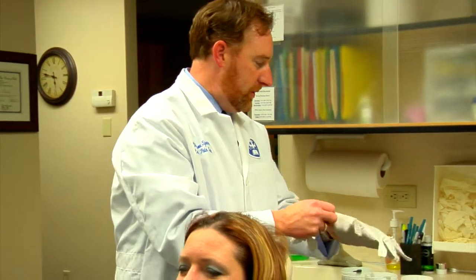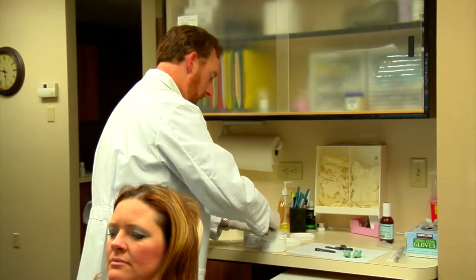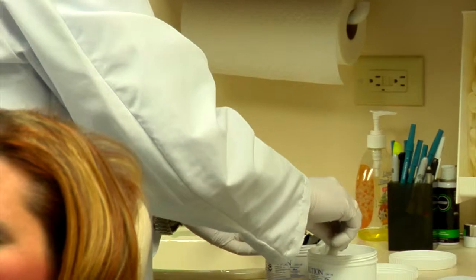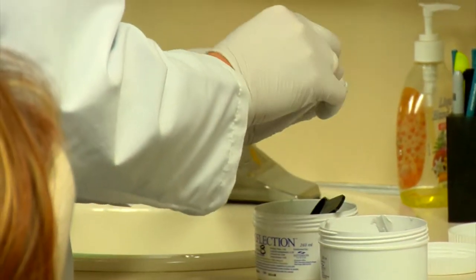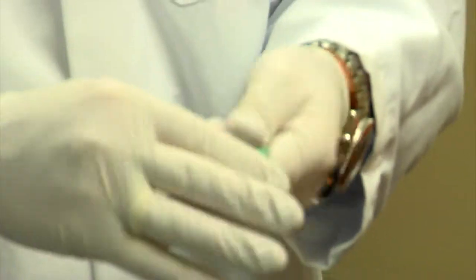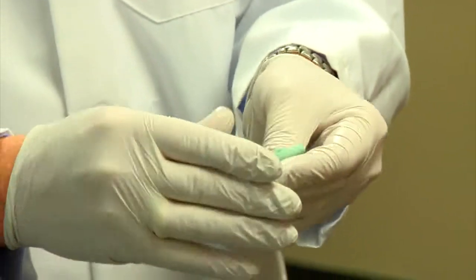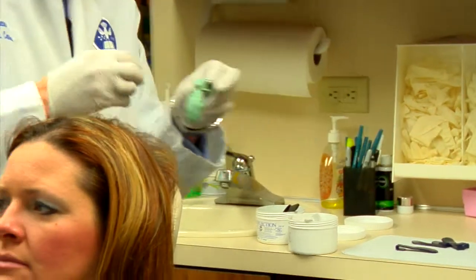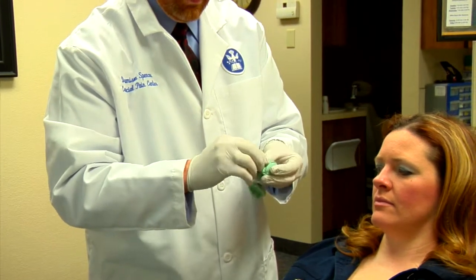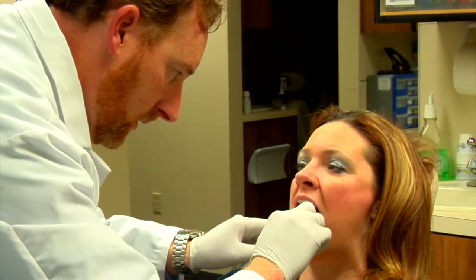the material itself bonds to itself. So all I did, as you saw, is I just wiped it off with a paper towel so that it wasn't overly wet with saliva. I will take a small amount of putty, but making sure it's in equal amounts, and go through that same process with just a small amount. Put that back in the teeth area there. The excess away. Open for me. And close into that spot.